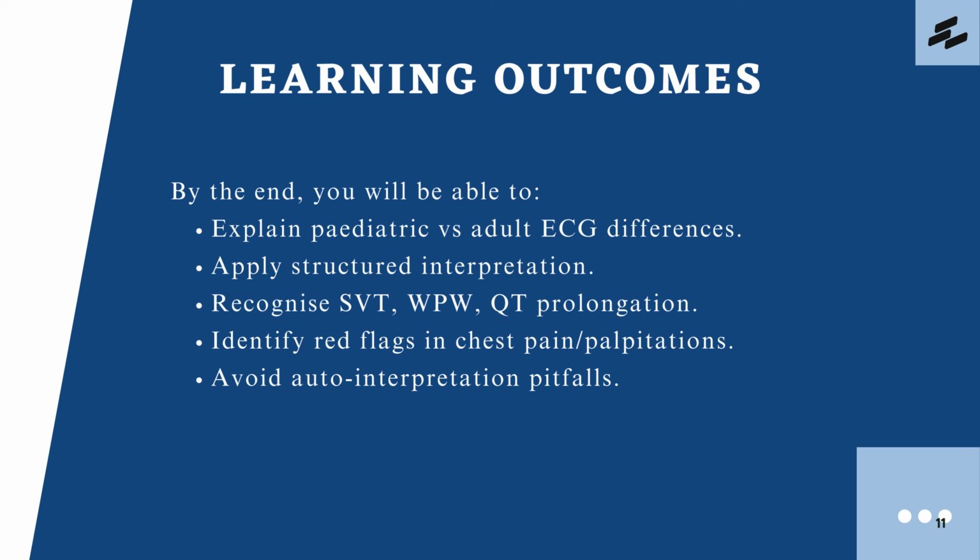Learning outcomes. By the end of this course, you will be able to explain how pediatric ECGs differ from adult ECGs, follow a structured workflow for safe interpretation, identify common arrhythmias such as supraventricular tachycardia, Wolff-Parkinson-White syndrome, and QT prolongation, distinguish benign chest pain from cardiac red flags, recognize the limitations of auto-interpretation, and apply clinical judgment. These skills will enhance your confidence in managing chest pain and palpitations in children and adolescents.